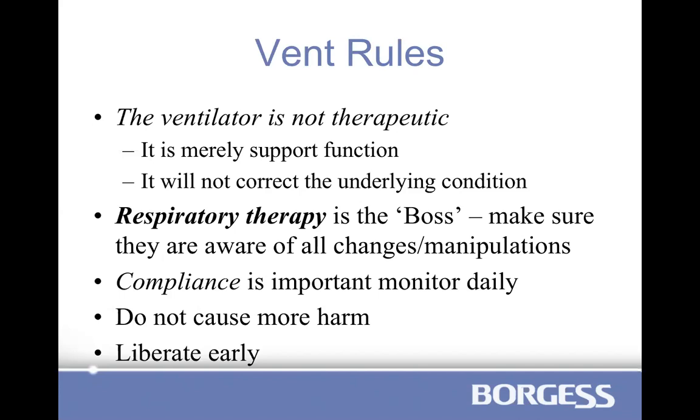Compliance, in terms of lung compliance, is something that we'll talk about a little bit later, but it is important to monitor daily because that changes in each patient on a day-to-day basis based on their disease process.